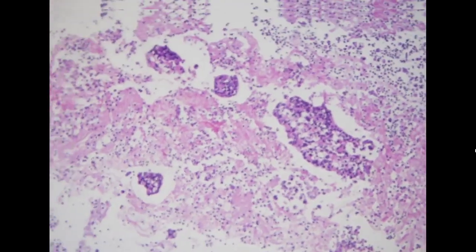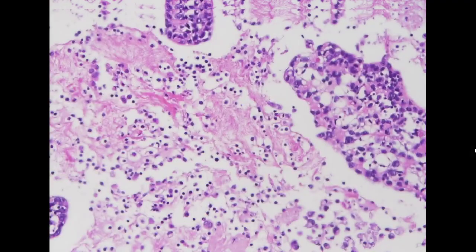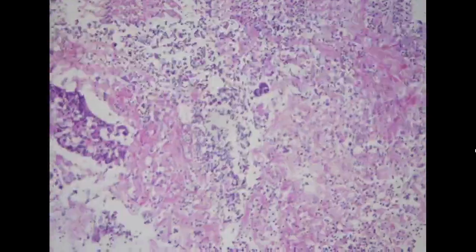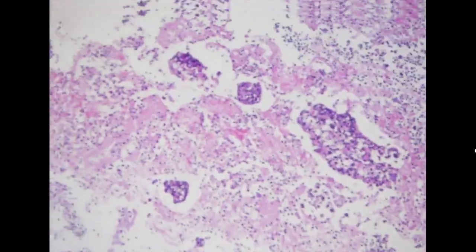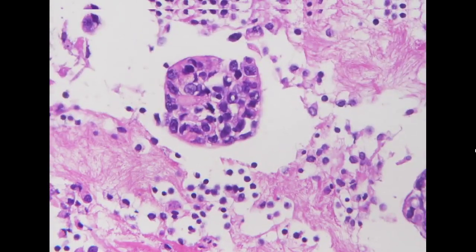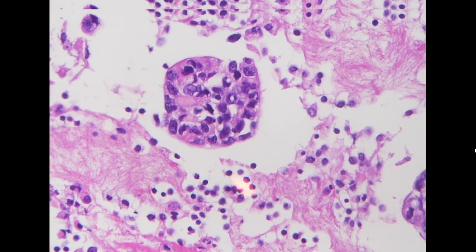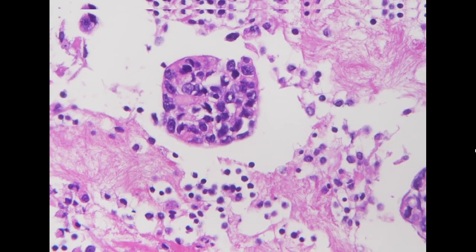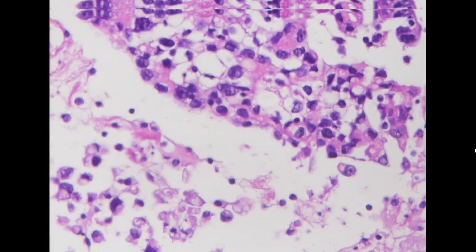We also received a cell block preparation. In this cell block preparation, the tumor cells are more frequent than in the cytospin preparation. You can appreciate clusters of cells with glandular-like features with a luminal border, and the nuclei are all very pleomorphic and atypical. So this is consistent with metastatic adenocarcinoma in the ascites specimen.